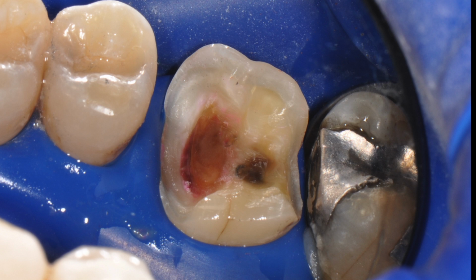Following caries removal, the outline prep is completed and smoothed. This tooth required full occlusal coverage and bevels were placed on enamel margins to enhance bonding surface area. Air abrasion was also performed to enhance bondability to the dentin.